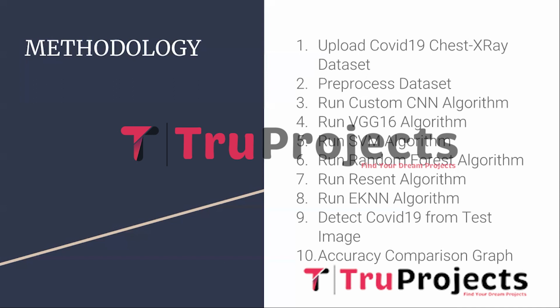And the fifth module is Run SVM algorithm. This module involves training a support vector machine model. SVM is a machine learning algorithm that can be used for classification tasks. Similar to the VGG16 module, this module trains the SVM model using the pre-processed dataset and calculates the evaluation metrics such as precision, recall, F1 score, accuracy, and confusion matrix.